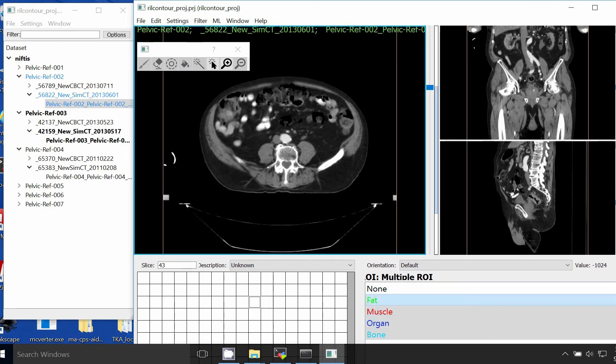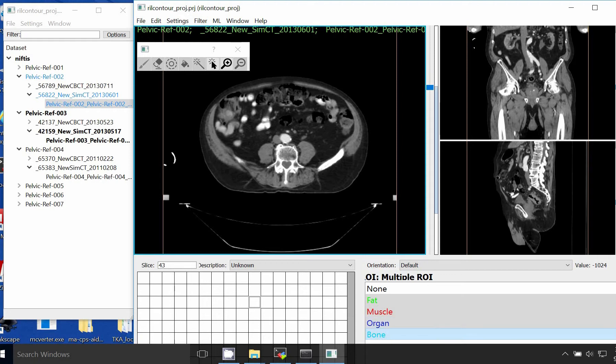We've defined four ROIs for this project: fat, muscle, organ, and bone.